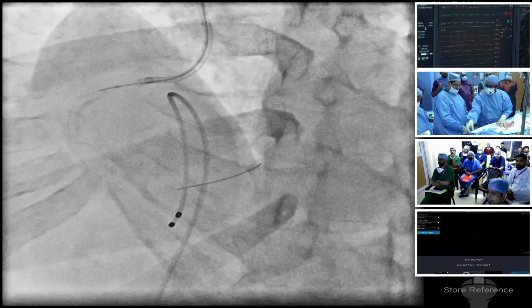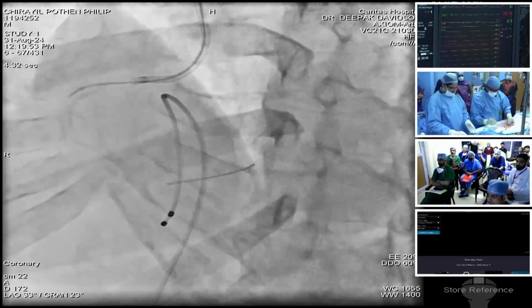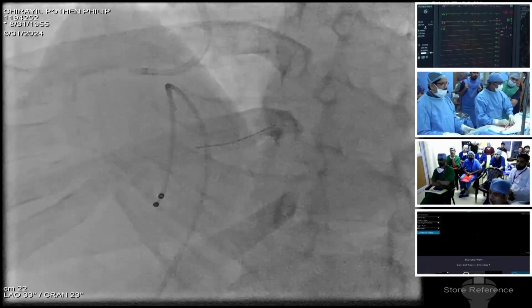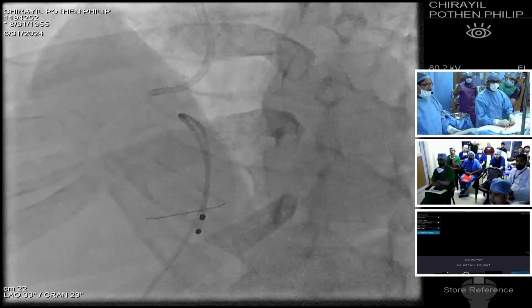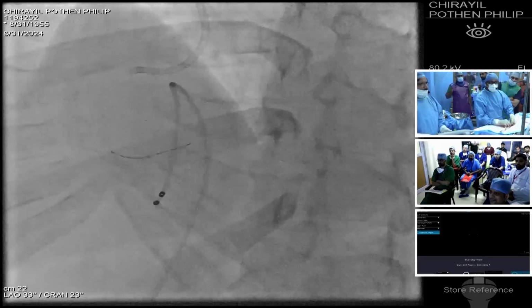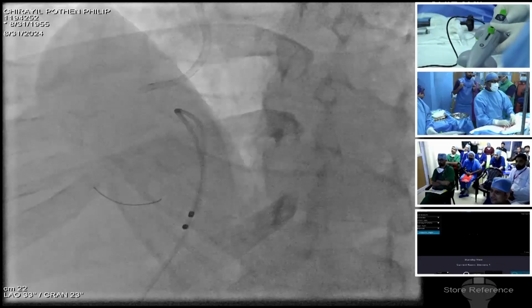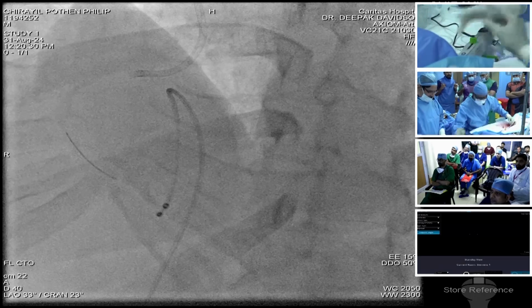I think we'll come out. Okay, we'll go to glide assist mode now, and one of us will be pushing the wire. That's 5,000 RPM. It's rotating and it's coming out. Yeah, we are in glide. That's the reason why you are hearing a small sound, 5,000 RPM only. Now the wire will come out. We'll switch it off.